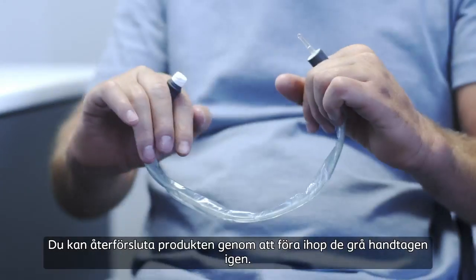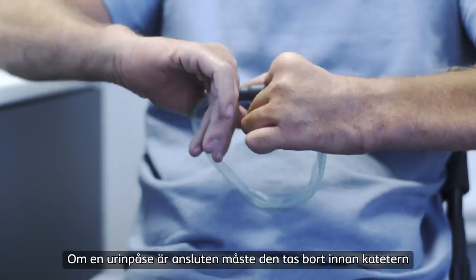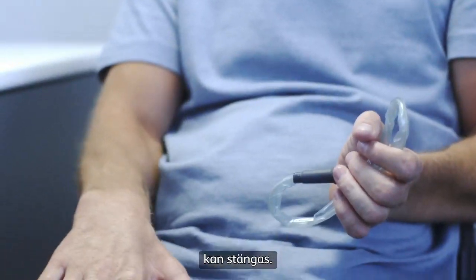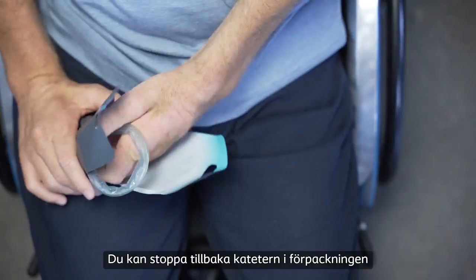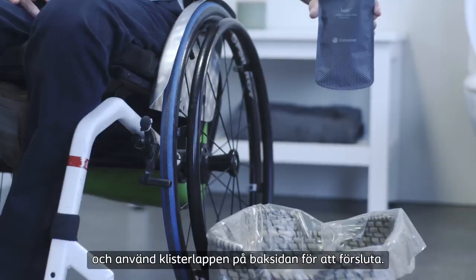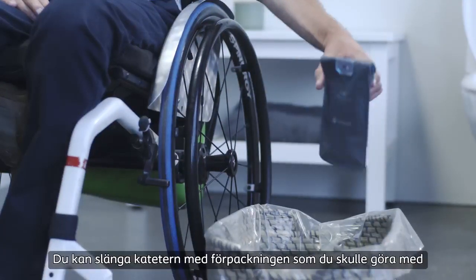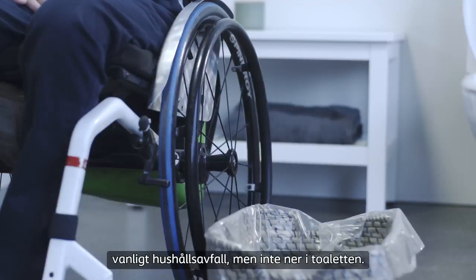You can re-close the product by rejoining the two grey handles. If a urine bag is connected, it must be removed before the catheter can be re-closed. You can return the catheter to the packaging and use the rear side label to re-close the packaging. You can dispose of the catheter and the packaging as you would with normal household waste, but not down the toilet.